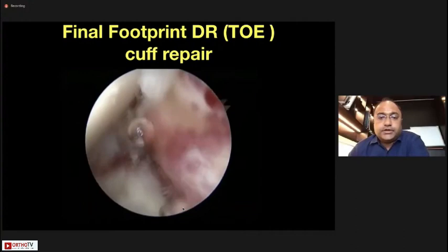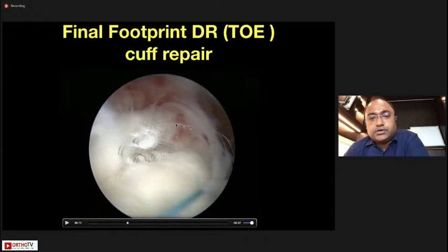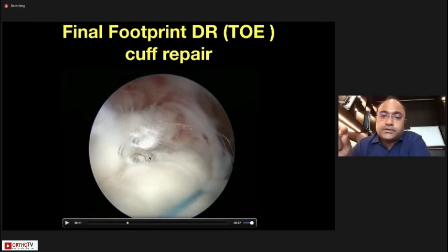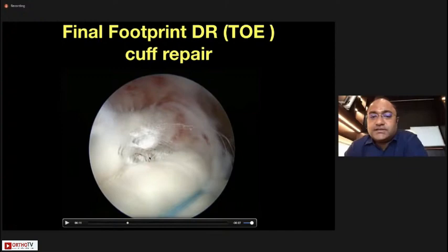One important tip: pass the stitches at least three to four millimeters away from the muscle-tendon junction, not right at it. Make sure each stitch is passed at a different point — not in a linear pattern — so that if there is a re-injury, the re-tear doesn't propagate linearly and render the entire cuff irreparable. Pass in a slight zigzag pattern away from the muscle-tendon junction to avoid a type 2 tear where the entire rotator cuff tears off leaving only muscle.